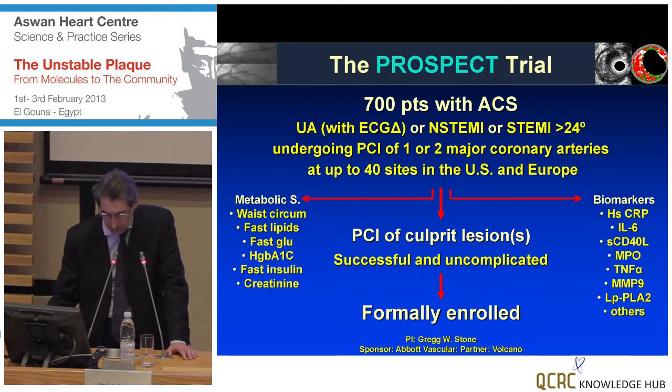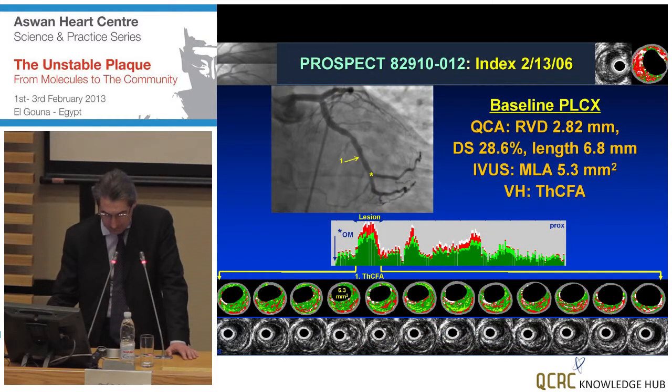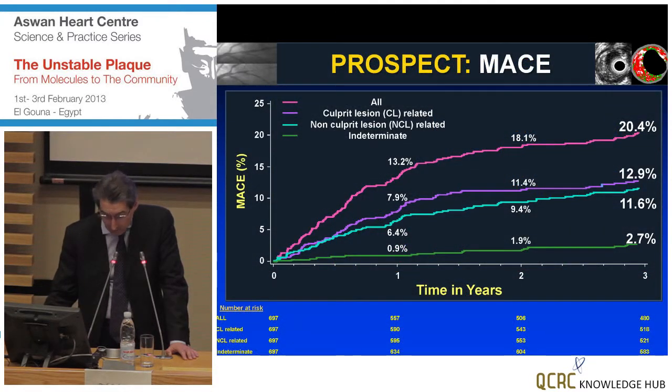Patients in which you did your job on the culprit lesion properly, and you examine then with intravascular ultrasound with the added benefit of a virtual histology imaging to assess the various components, fibrotic plaque and lipid-laden plaque, the first 6 centimeters of the other 2 arteries, assessing them also with QCA and measuring areas. The outcome, I think, is very interesting.